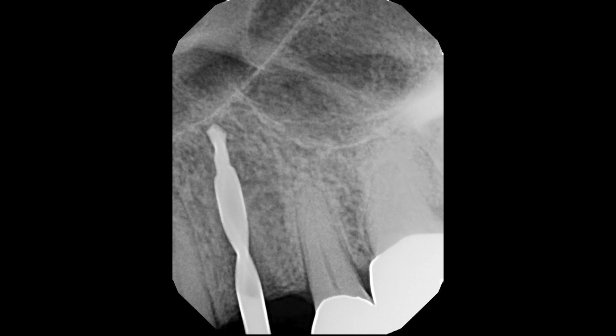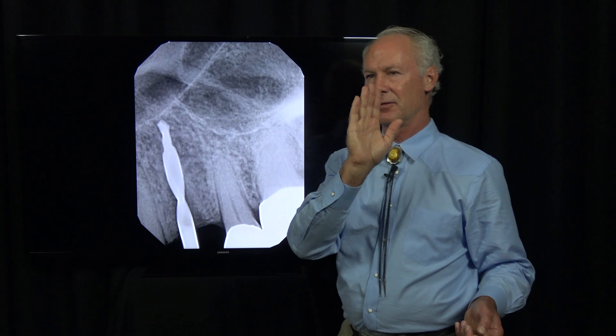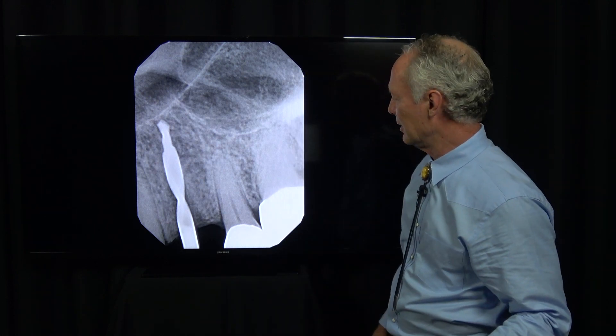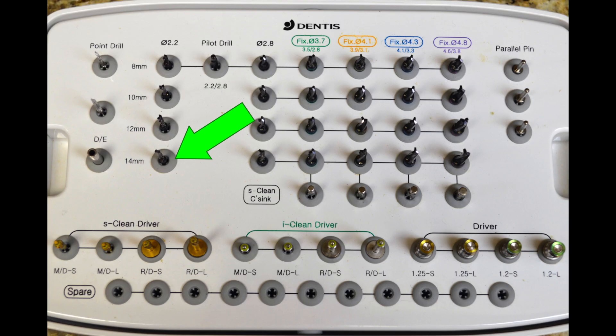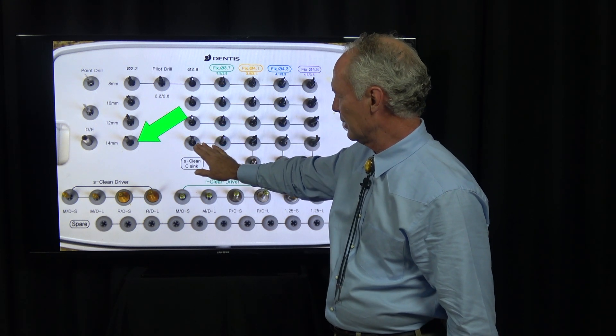The longest root-form implant I'm using is 14mm, so that's plenty of depth. It's lined up perfectly along the long axis of the adjacent teeth. I take a radiograph and see it's ideal—right in the middle. I check it from the facial and buccal to ensure proper alignment.